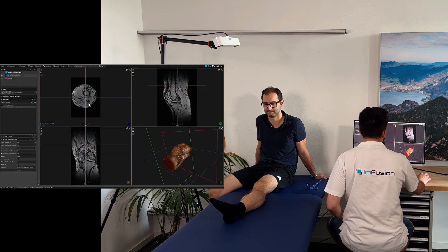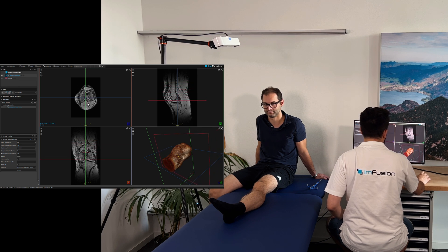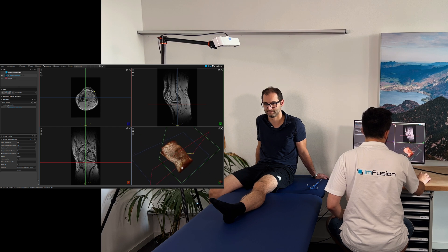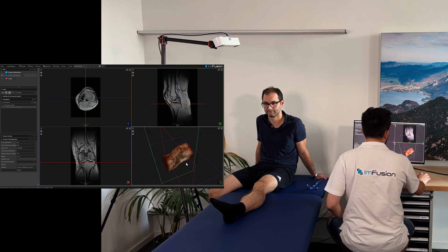This is the MR scan we will be registering to, as visualised in our software. Here we have to find a point on the knee to which we will navigate a pointer device based on the registration result.